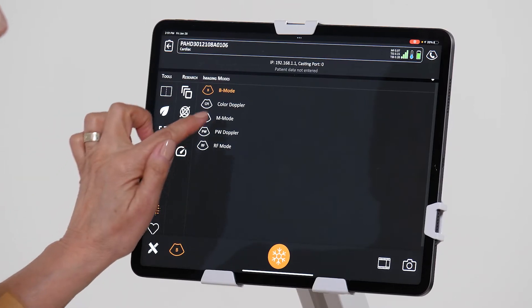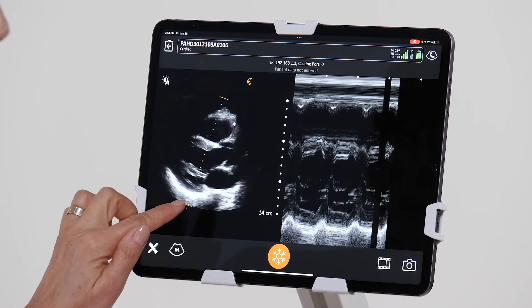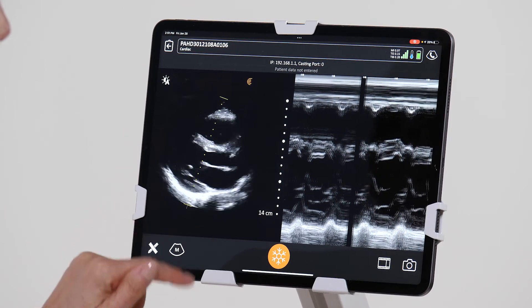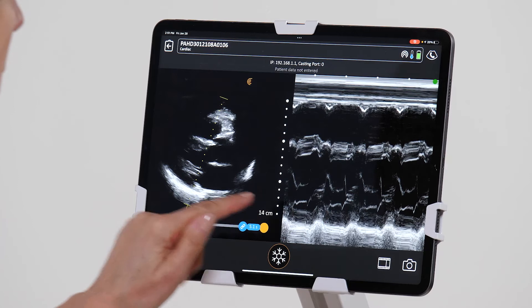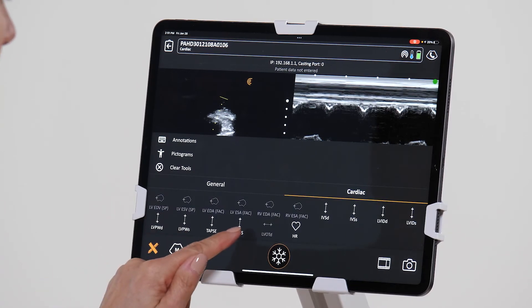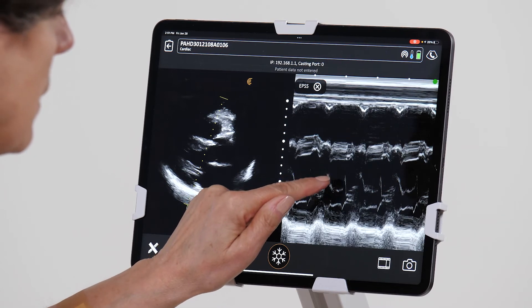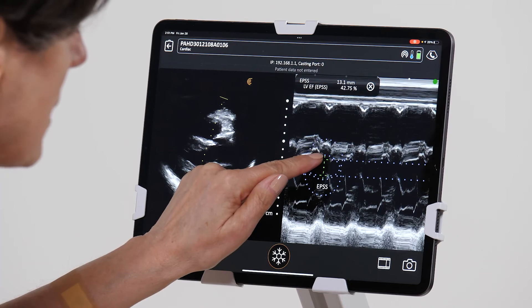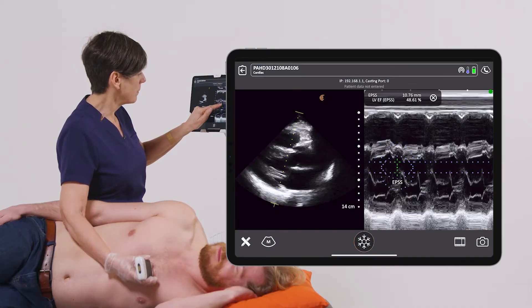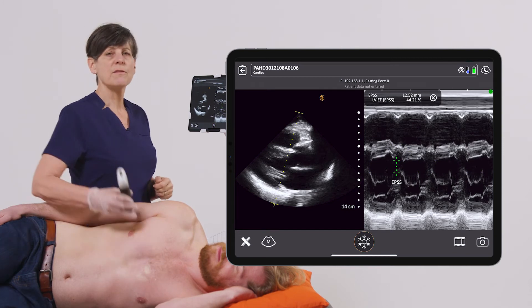I'm going to go to M mode. Place the line at the tips of the mitral leaflets. And once I have a good M mode of the mitral valve, I'm going to go to Calculations, EPSS, and place the first caliper at the E-point of the mitral leaflet, the second caliper at the septum, and we have an ejection fraction estimate of 44%.